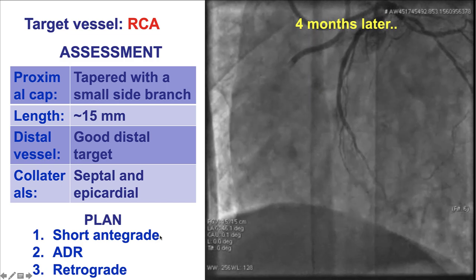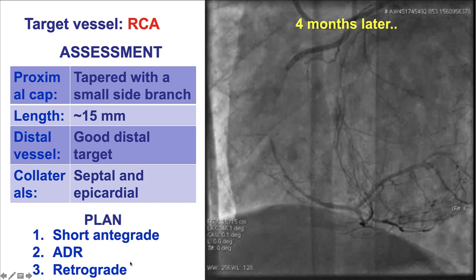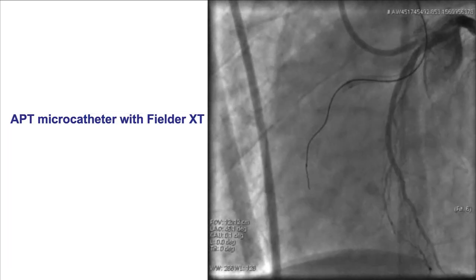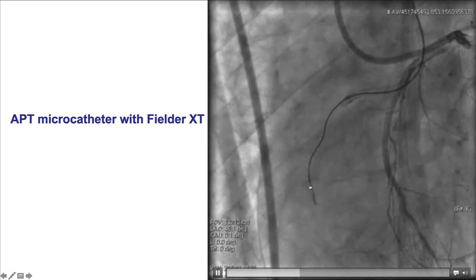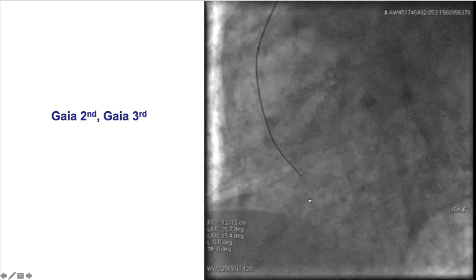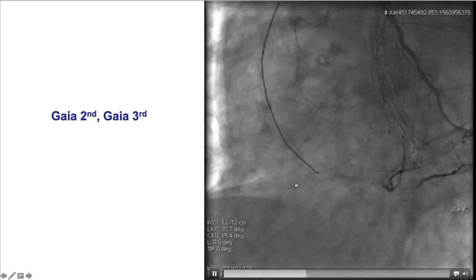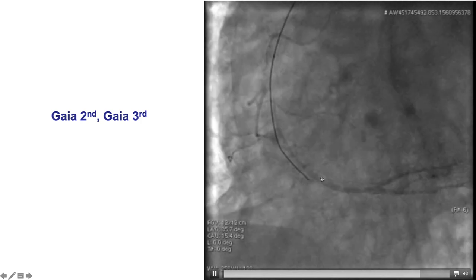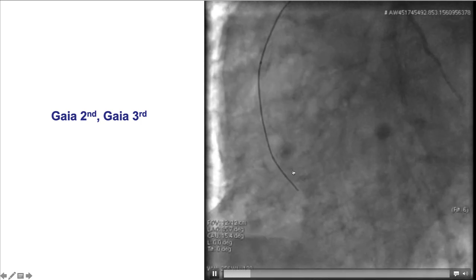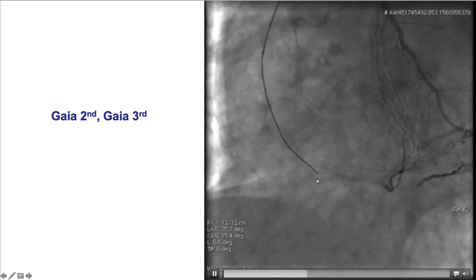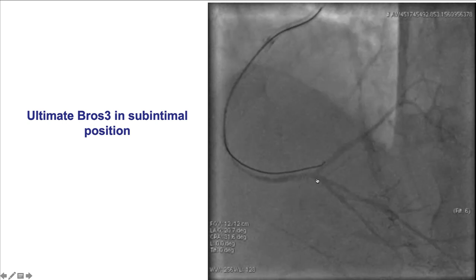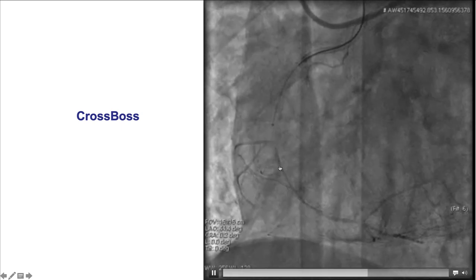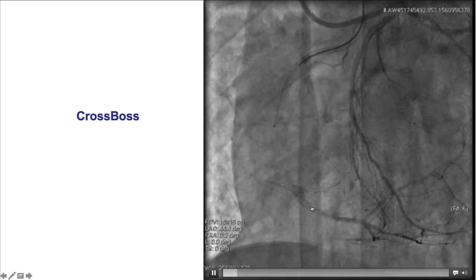The plan was for antegrade crossing followed by antegrade dissection reentry if needed, followed by a retrograde attempt. Antegrade wiring with the Fielder XT, followed by Gaia 2nd and Gaia 3rd was attempted. The wire clearly moved into the sub-intimal space with quite some distance between the false lumen and the distal true lumen. The same occurred for the Ultimate Bros 3 guidewire. A CrossBoss was also used but it just tracked through the same course of the guidewire.